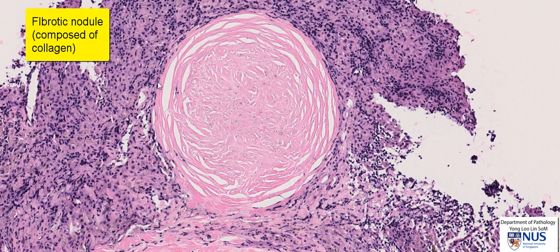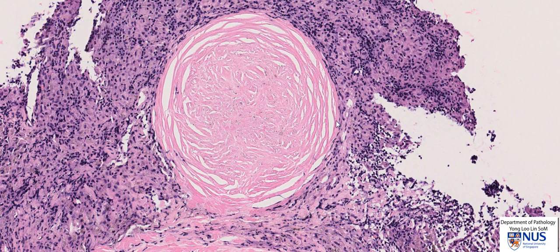Usually you can see that it is laid down in a concentric fashion. Sometimes there may be a thicker rim of more mature collagen at the periphery, and at other times there may even be calcifications laid down at the periphery of these nodules. We don't see any calcifications here, but if there are calcifications on imaging, they may appear like eggshell calcifications.